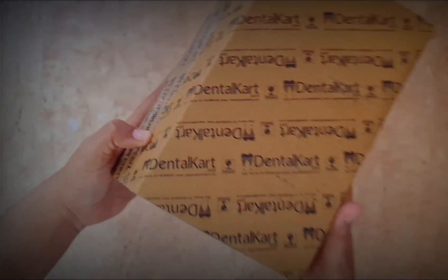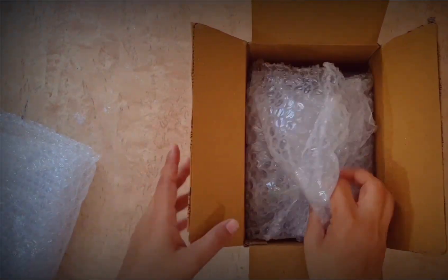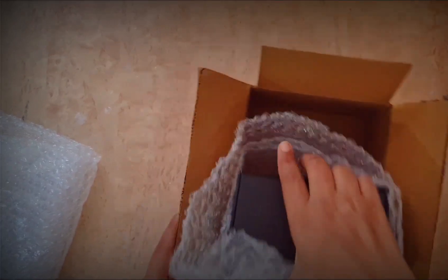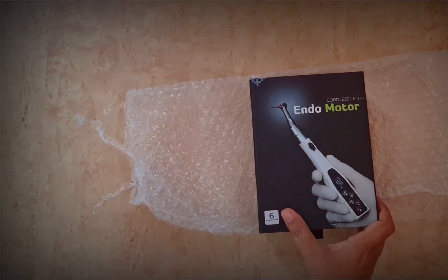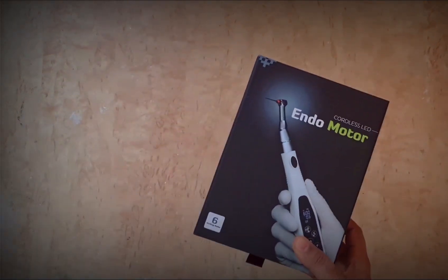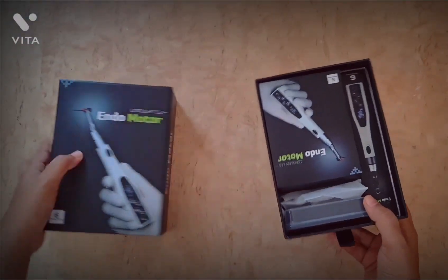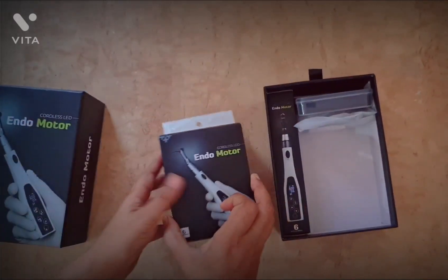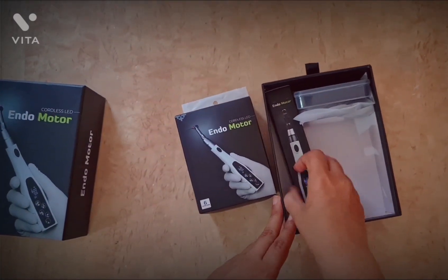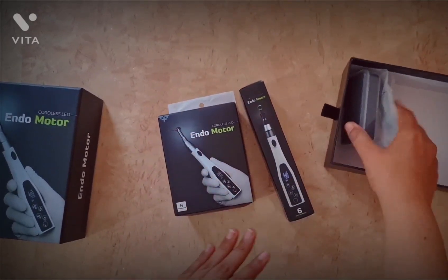I bought this Endoking cordless LED endomotor for the best price from Dental Cart. At the time it cost me rupees 7,500 — I got it for 62% off. This endomotor is worth rupees 19,900, and if you buy two or more you will get an additional 1.3% off. It's a hundred percent genuine product, comes with a 10-day return policy, and I did not pay any shipping charges for it.